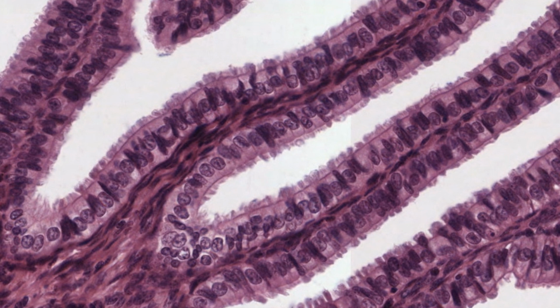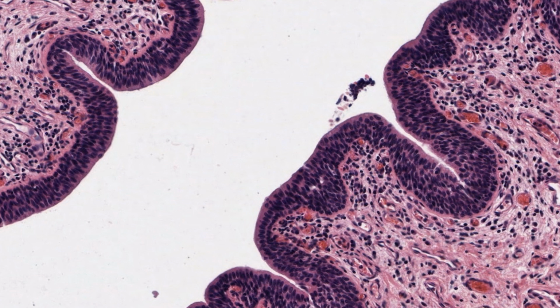I mentioned the term basement membrane a little while ago. This is a section of the lining of the male urethra as it passes through the penis. This epithelium is of a stratified type, which I'll describe later. But unlike in most epithelia, here the basement membrane underlying the epithelium is quite thick and stains bright pink.